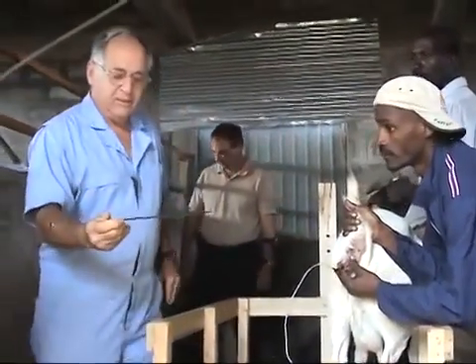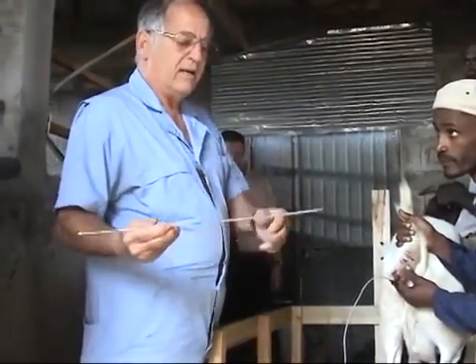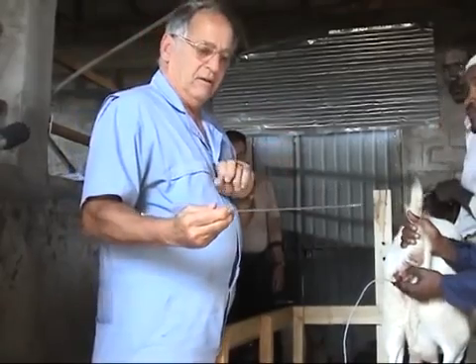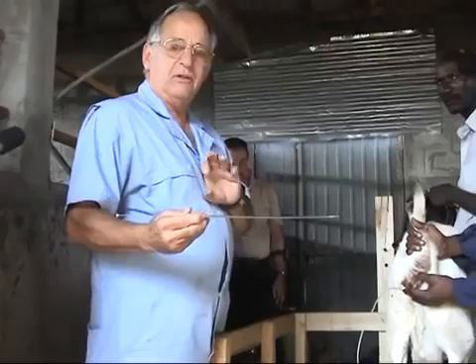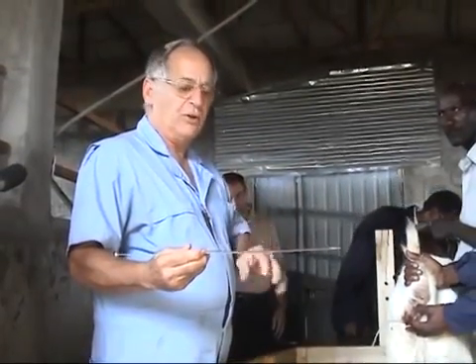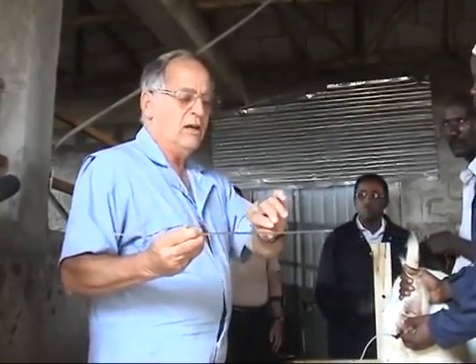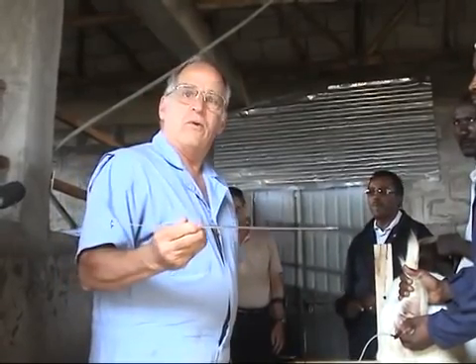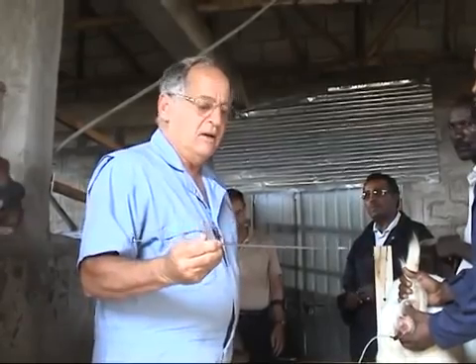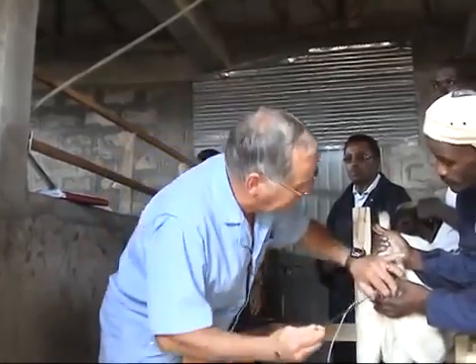We've loaded the inseminating gun or pipette with the sheath on the outside and the semen on the inside. Semen usually comes in two different types of containers, both called straws — either a half or a quarter cc straw — so you'll need the appropriate equipment depending on the type of straw. In this case we're using a quarter cc straw. This gun allows you to use either half or quarter cc straws, which makes it a lot easier. We're ready now to locate the cervix, penetrate it, and deposit the semen.